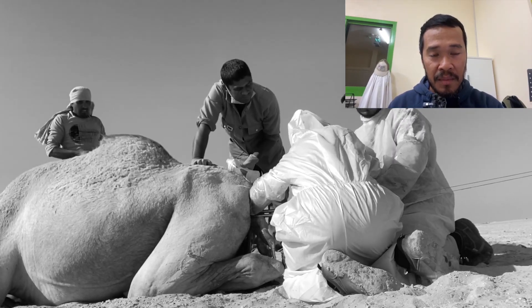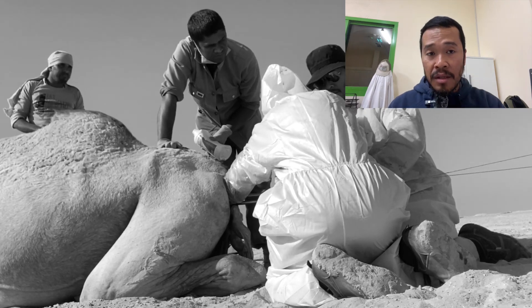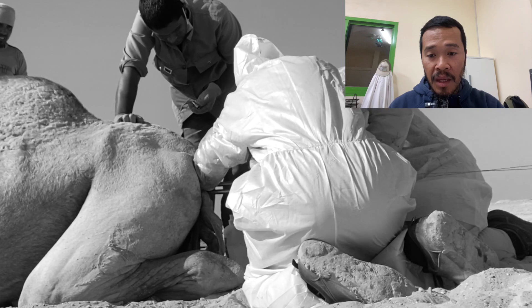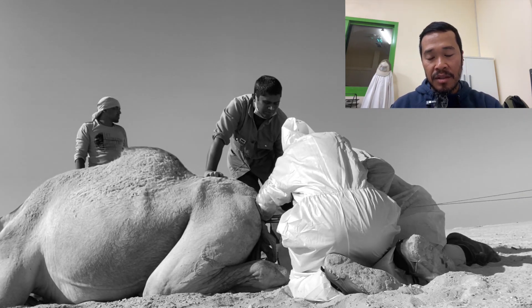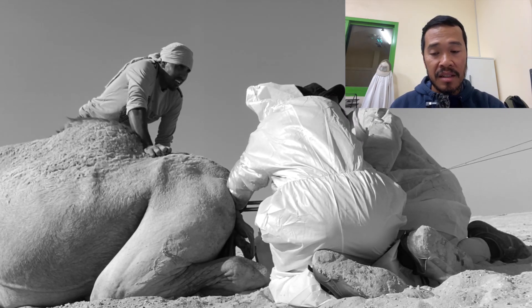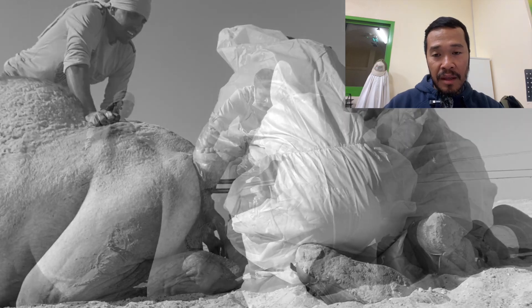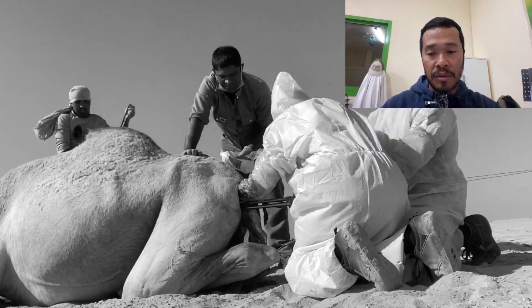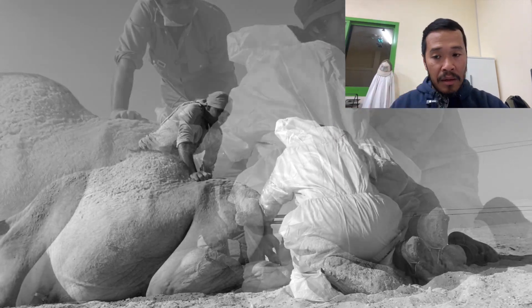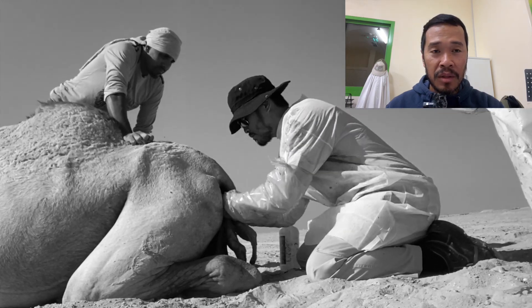It's essential to restrain the animal properly so the procedure can be done cautiously. This is a delicate procedure not to be taken lightly — always ask for professional help if you don't know how to do it. As you can see in the footage, we are using the wire saw to cut the neck portion of the fetus while it is still inside. My supervisor holds the tool from the inside while I hold and push from the outside as we cut.